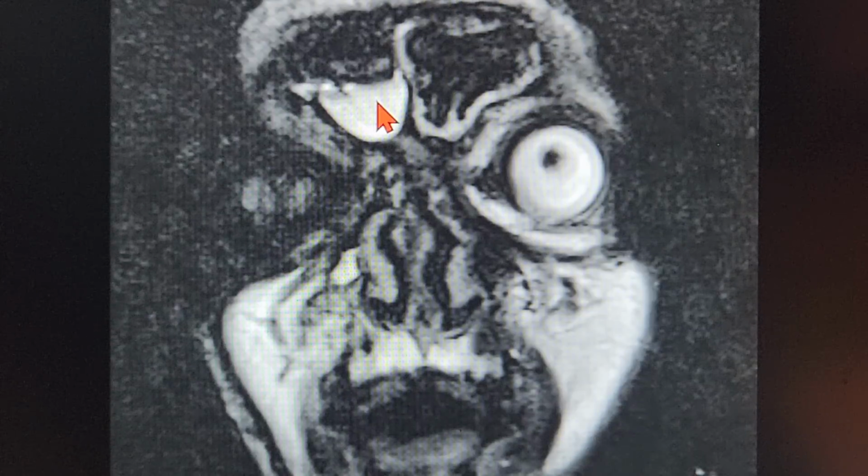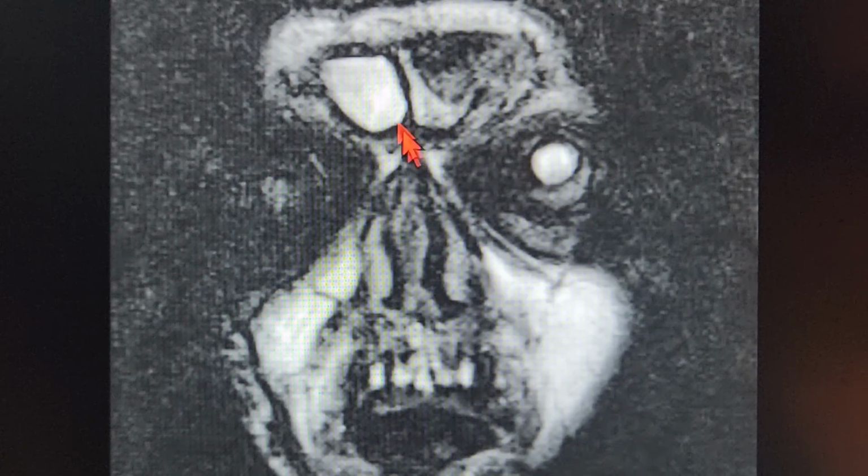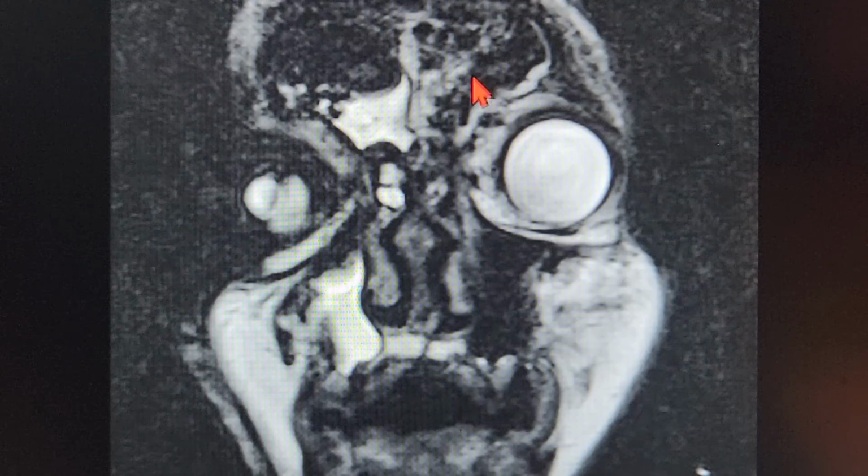You can see that's the CSF in the patient's frontal area. That's the frontal sinus on the patient's right side. And as I keep on going behind, you can see that's the CSF in the patient's right frontal. That's stooping down, flowing down into the frontal recess area in the upper half of the sinonasal area, just towards the skull base.